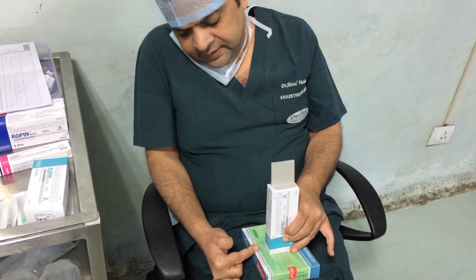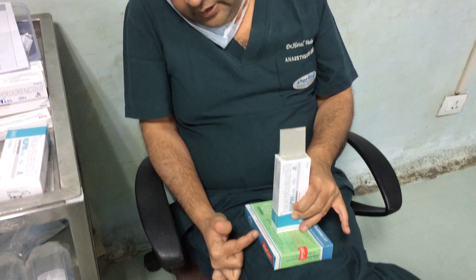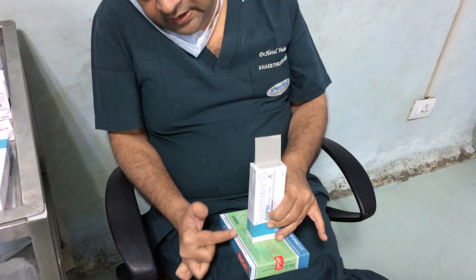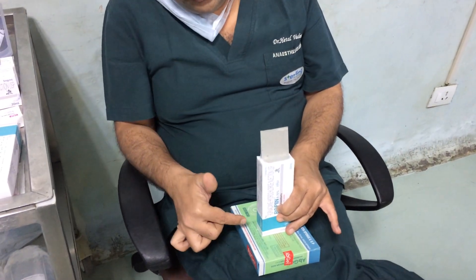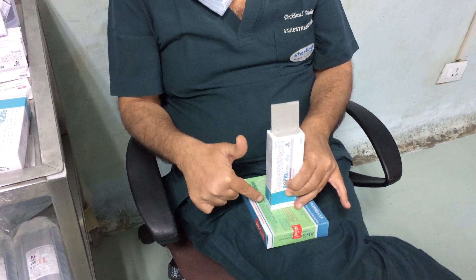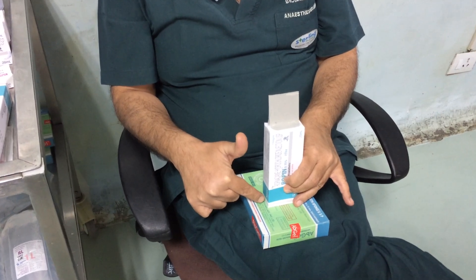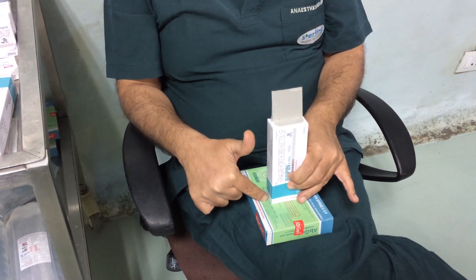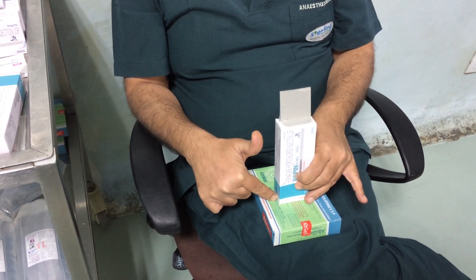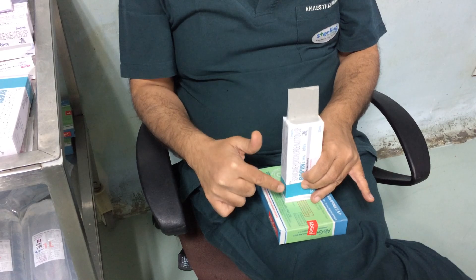So suppose your probe is perpendicular to the skin — your needle will be at the midpoint of the ultrasound probe and it will be nicely visualized.